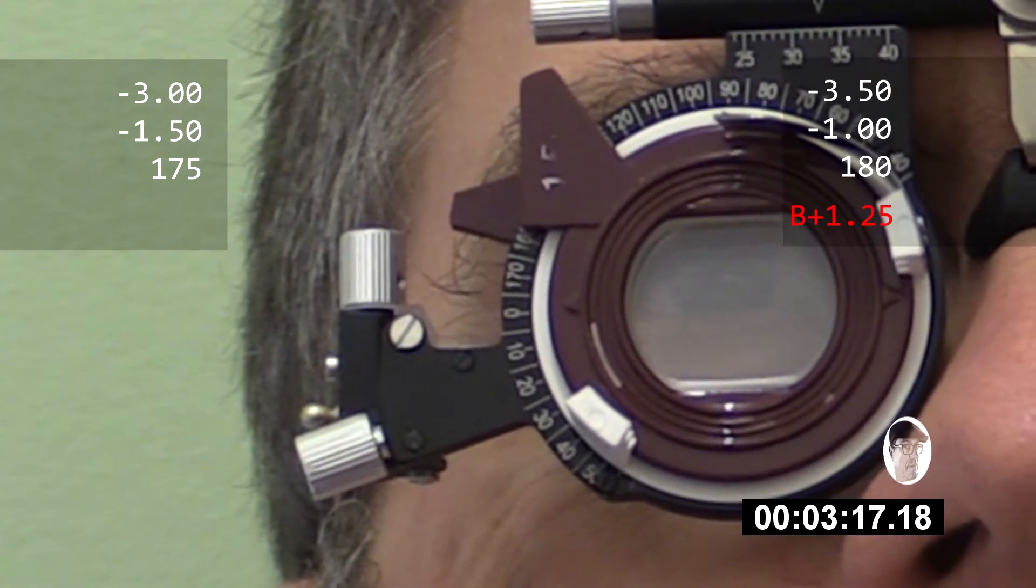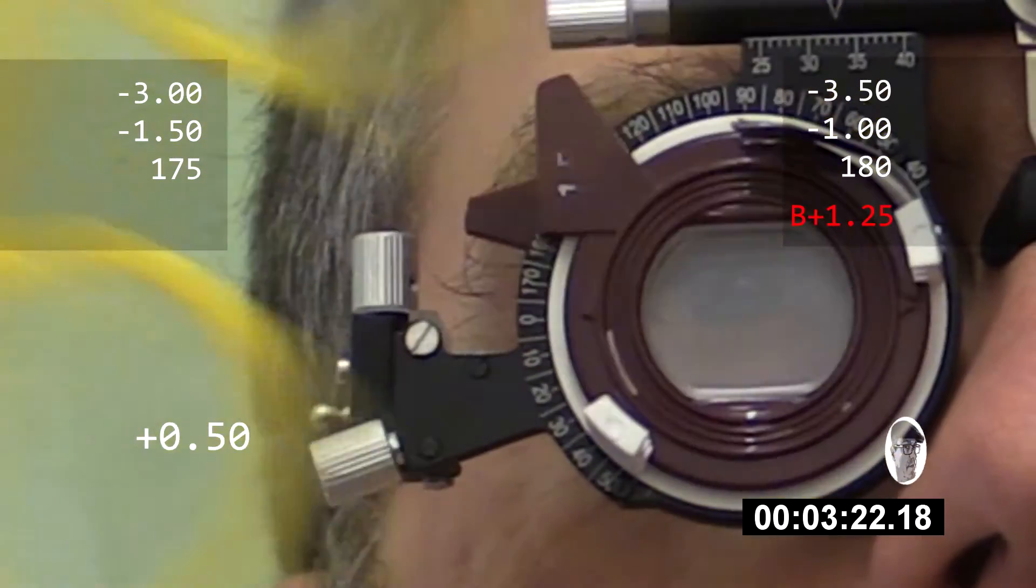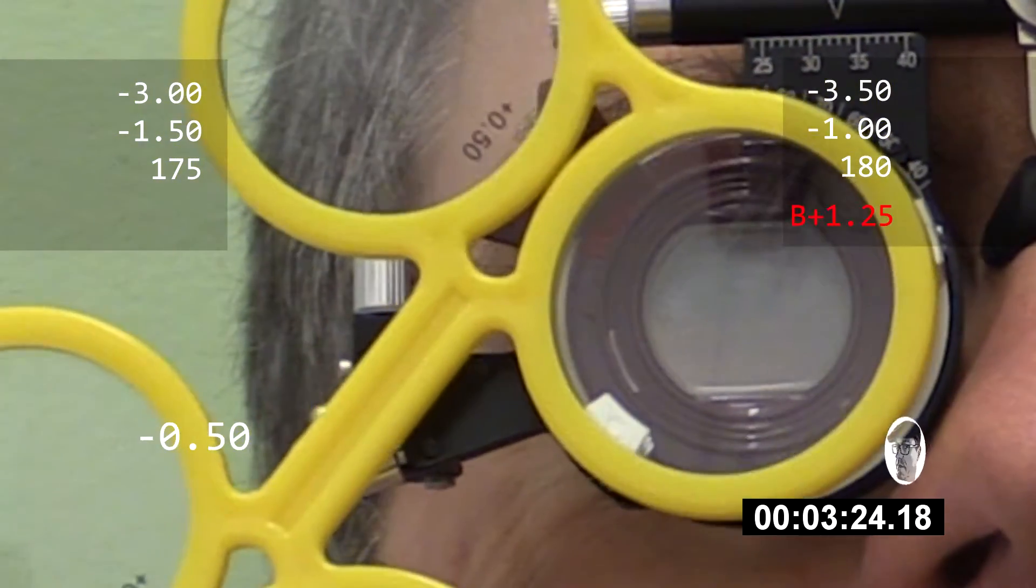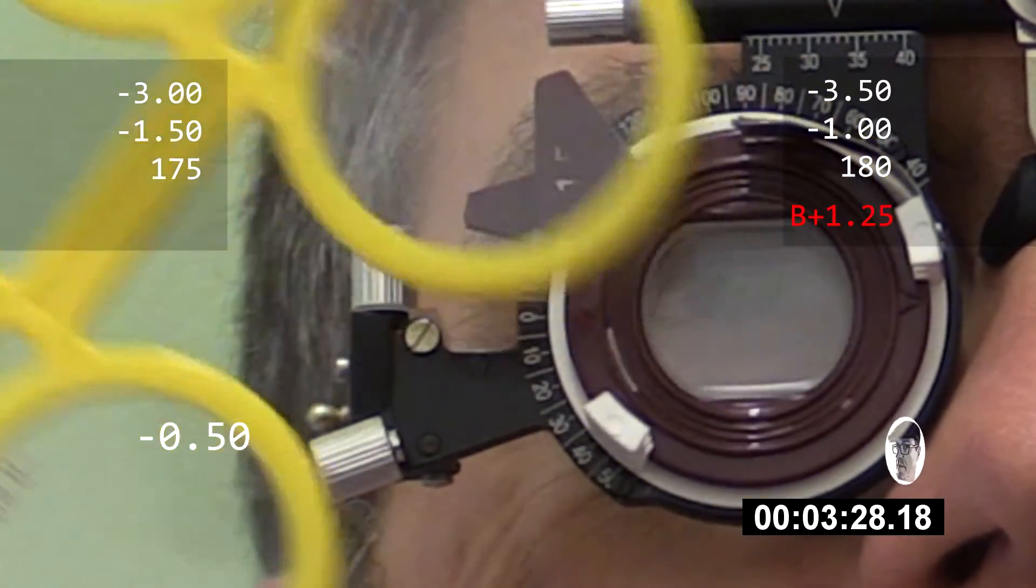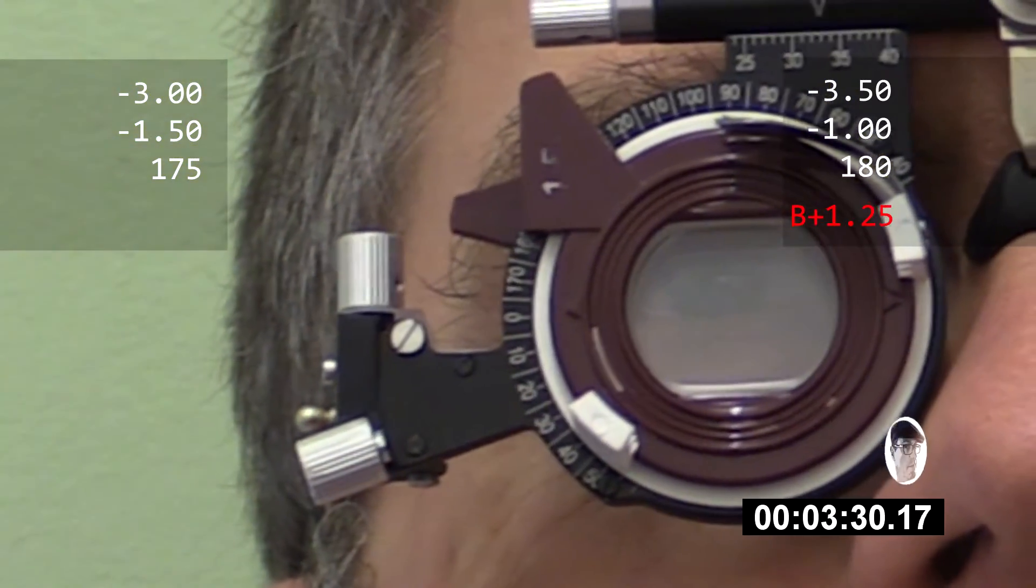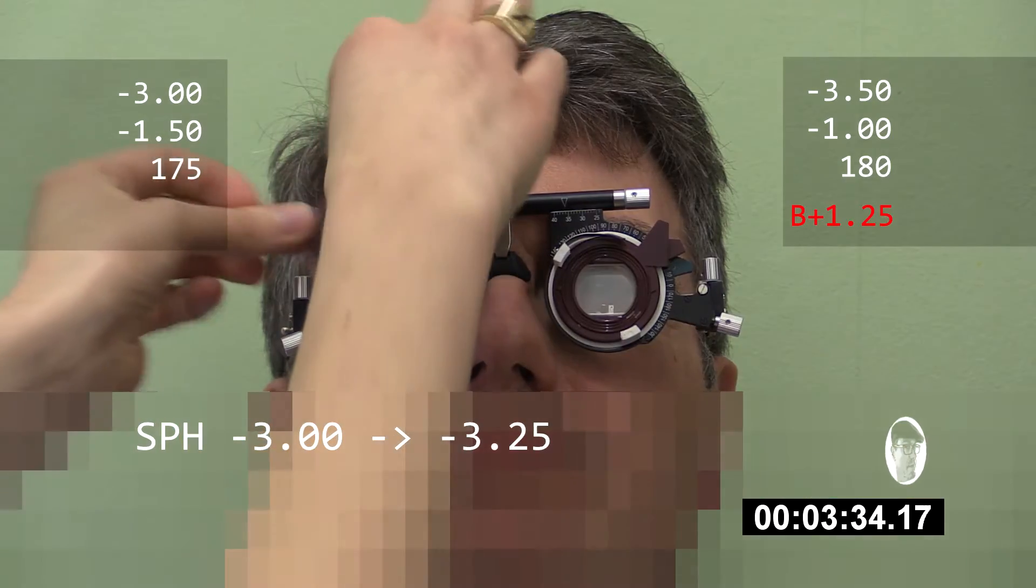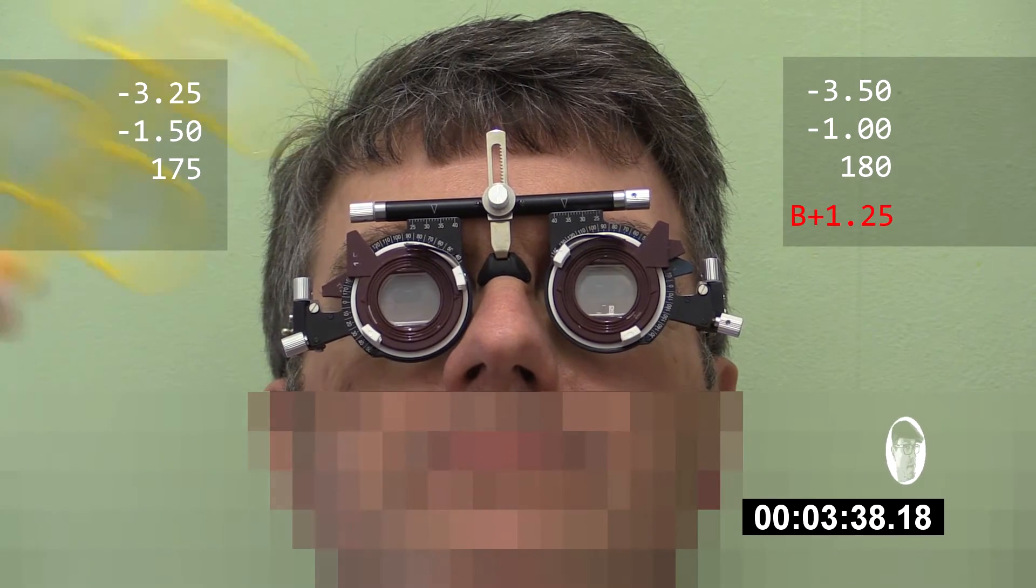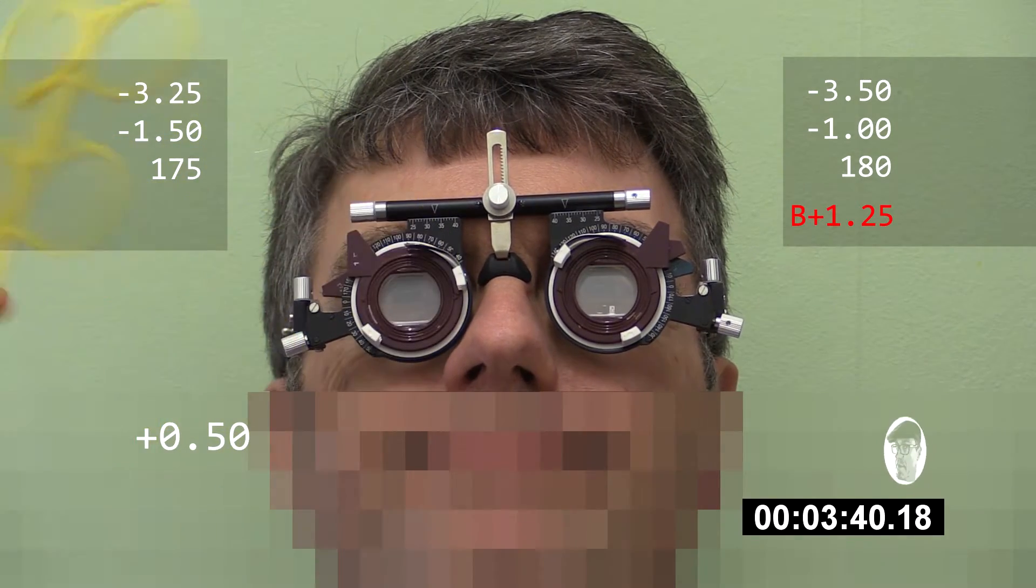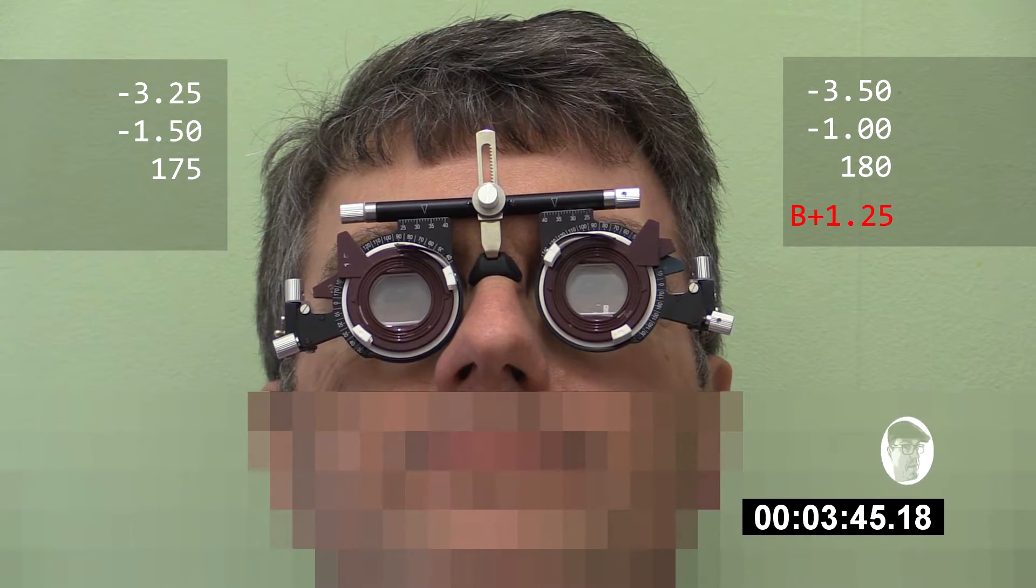And looking back at the chart of the smallest line that you can see, is there any clearer with, without, and with, or without? I can show you that again. With, without. Maybe slightly with, yeah. Just that slight bit. And with, without, and with, without. Perfect.